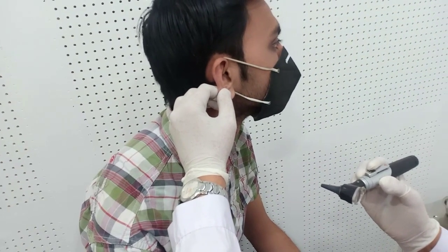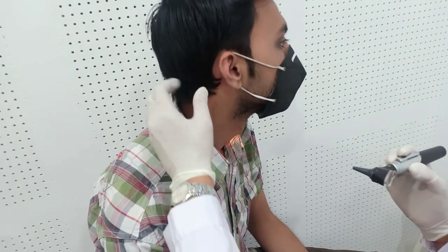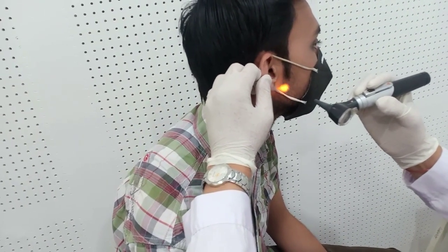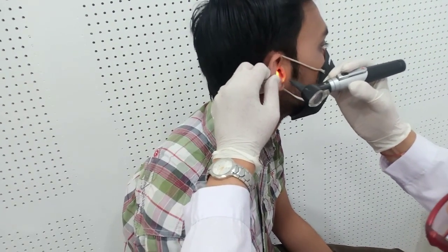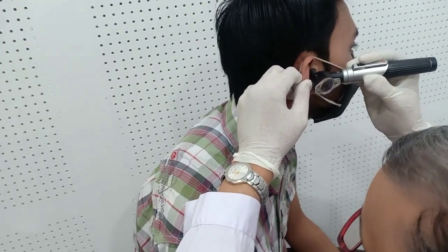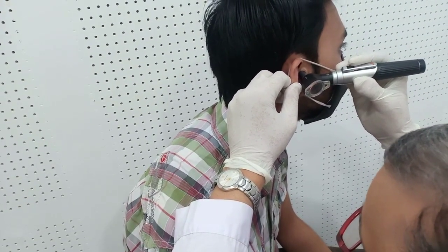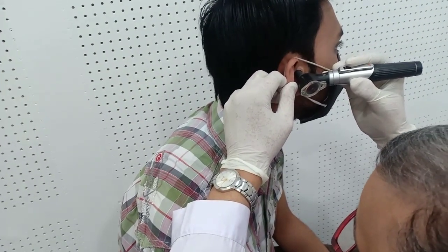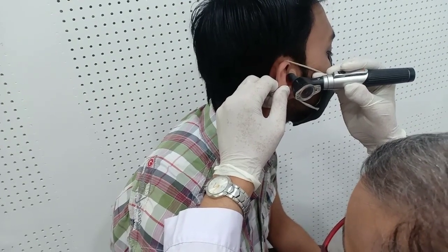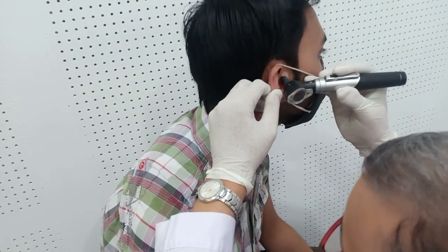The rest of the directions remain the same, but for children it should be retracted inferiorly, while in adults it is posteriorly, superiorly and laterally. Again, I can see the tympanic membrane very nicely. There is no perforation, no granulation, no retraction. The color is normal, the placement is normal, there is no bulging, no retraction.